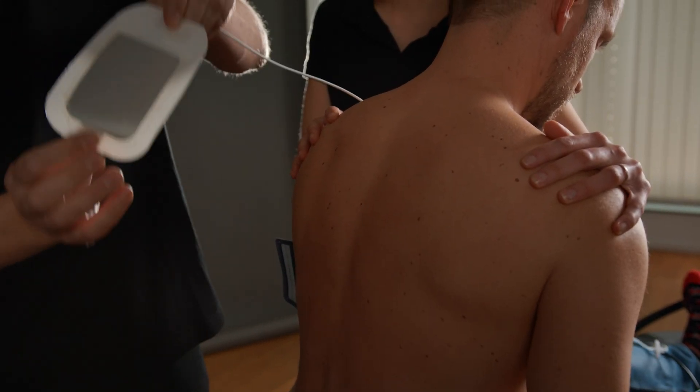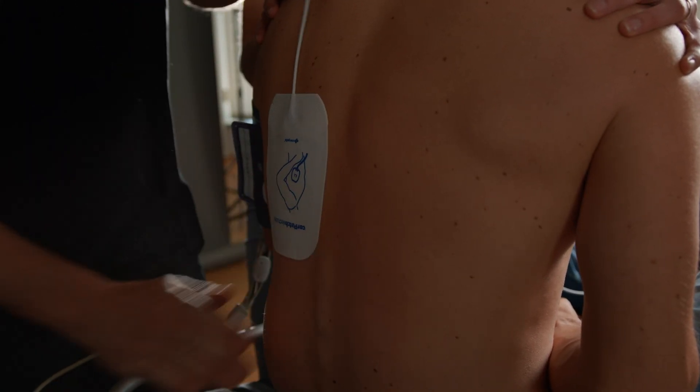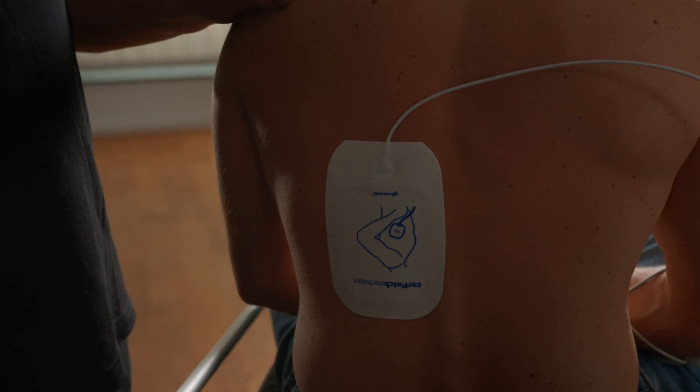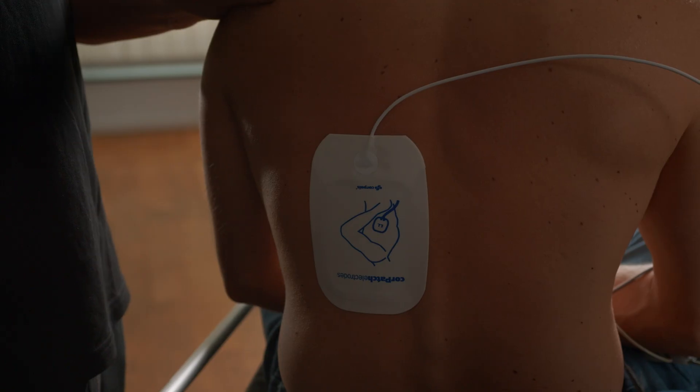Here, we adhere the electrode flat and make sure that no air bubbles are created. In addition to the anterior-posterior method of application, all other common application methods are of course permitted.